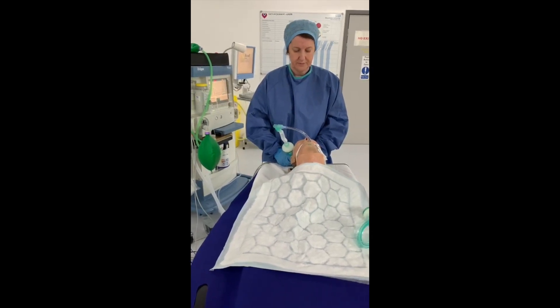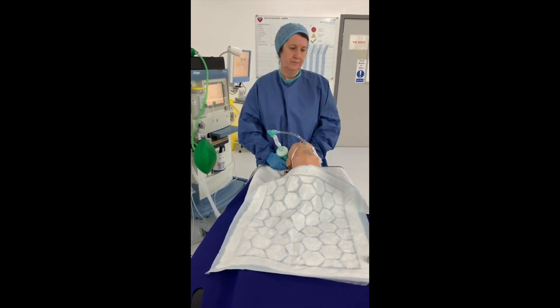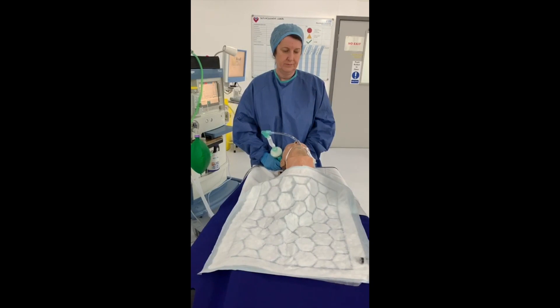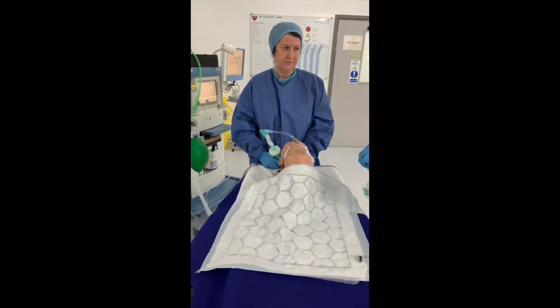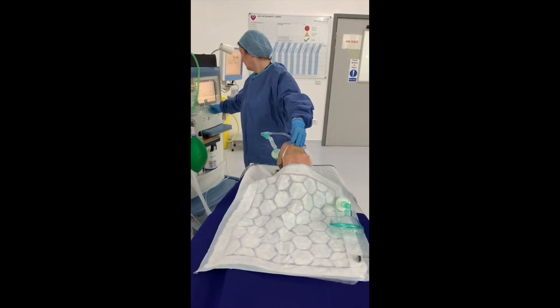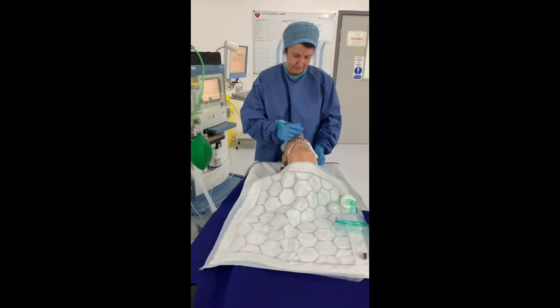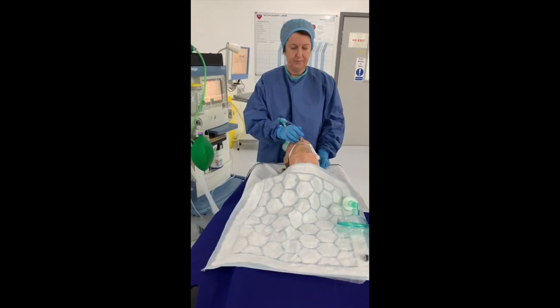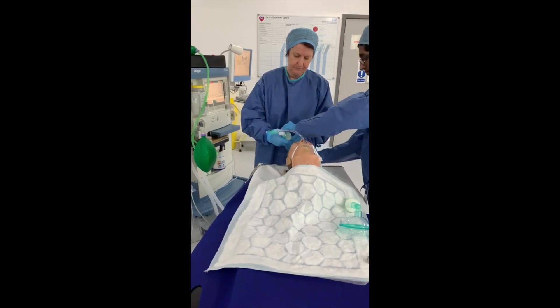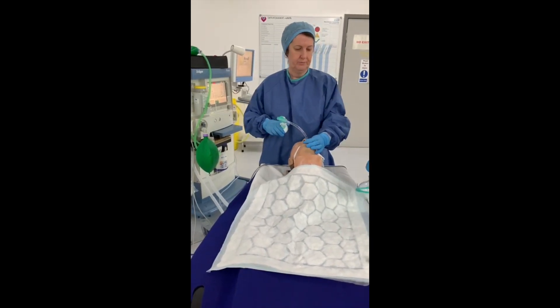Assist one is to ensure a new face mask, angle piece, catheter mount, and HME filter are assembled and ready. The intubator will turn off the ventilator and await the patient's end expiration. Assist one, on command of the intubator, will disconnect the ventilator leaving the HME filter attached to the patient, and attaches the new circuit to the ventilator.